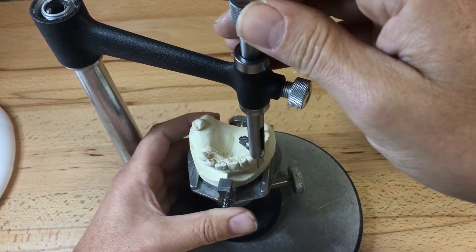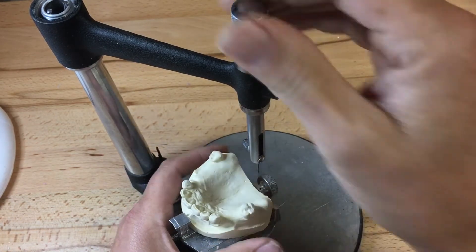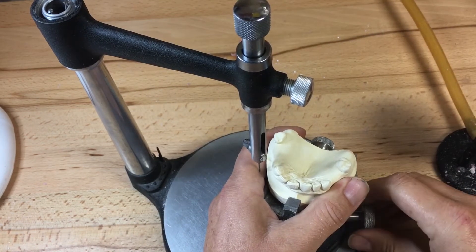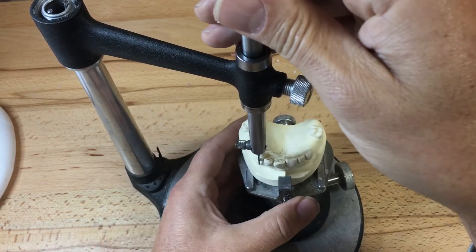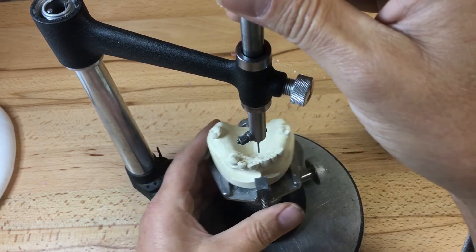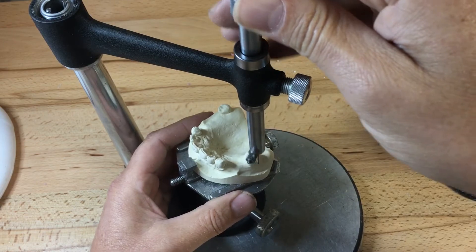I'm going to tilt the model slightly backwards to see if I can get these clasps lower, which I can, without introducing any undercuts on the guide plane — very slightly on the 1-3 and zero on the posterior molars. I think I've gone a little bit too far to the left-hand side. There's no right or wrong; there's just a closer to more advantageous than less when we're doing path of insertions. Everyone's will be slightly different.